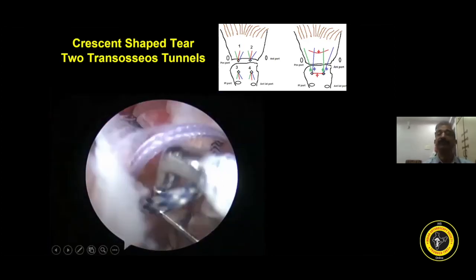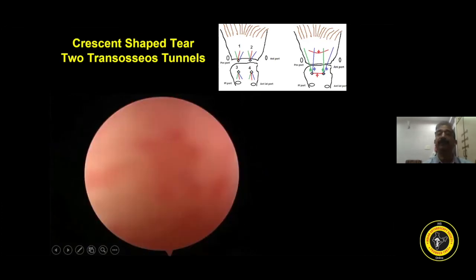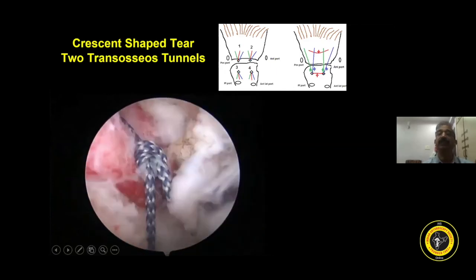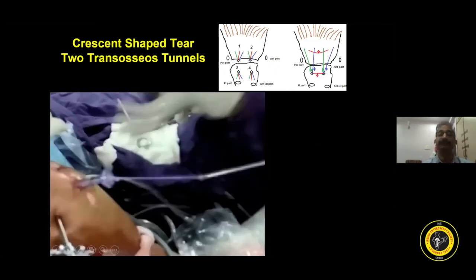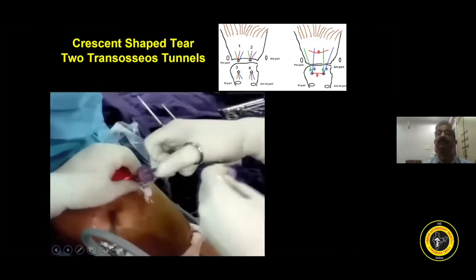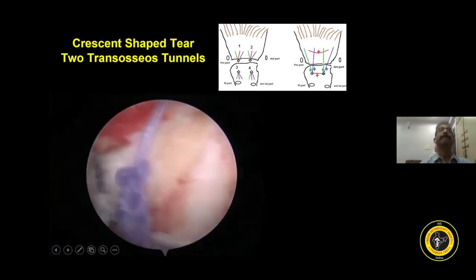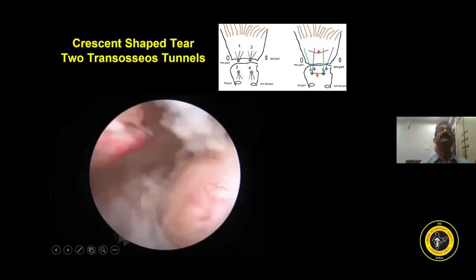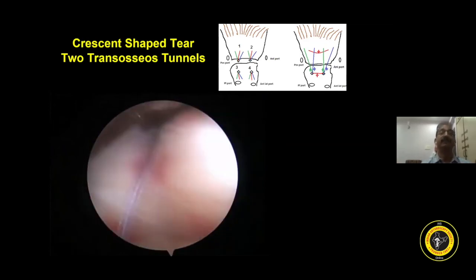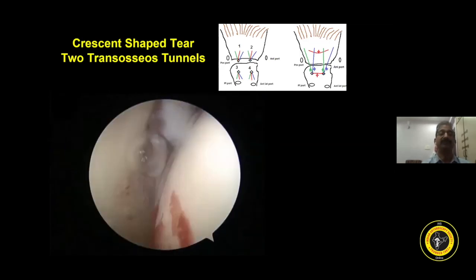Now I put out two blue sutures across this interlinking grid suture, take the two blue sutures, and make a knot. Now I tie the knot of the red sutures on the bone, giving a non-absorbable rectangular suture construct. Then I pull the green sutures — two limbs from the anterior channel — across the interlinking suture. Similarly, from the last tunnel, two limbs are picked and the knot is made. You can see the cuff is evenly compressed tightly to the footprint with bridge sutures at the greater tuberosity. It is really well compressed, and in the intra-articular view you do not see any bare footprint.